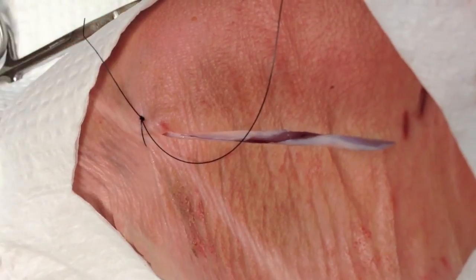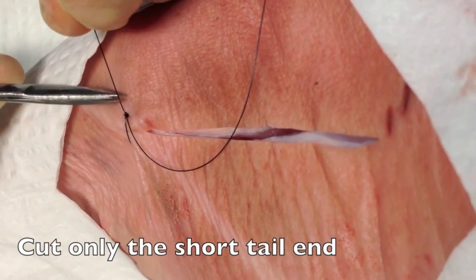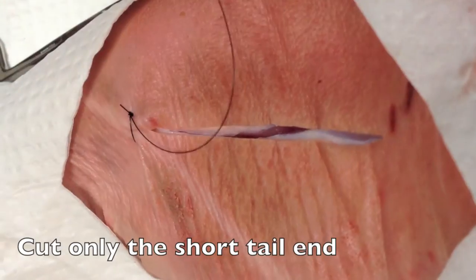Now at this point, instead of cutting both ends as you would with a simple interrupted, you're only going to cut the short end of the suture material. From here, you're going to continue to run that suture across the wound.